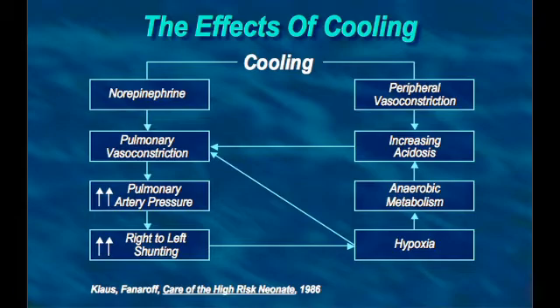And so a sick baby, again, could be just in a thermal environment that is not suitable to them. And that can be changing on a frequent basis, so it's something to be considered. I've seen preterm babies where the door was left open in the incubator, and you come in and the babies are having apnea and bradycardia, and you find out the temperature is just too low, and that's all that's wrong with the baby. So they can respond very violently to being cold.